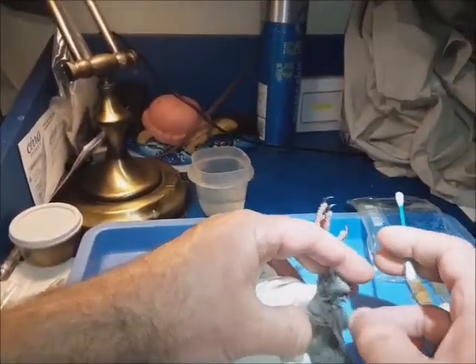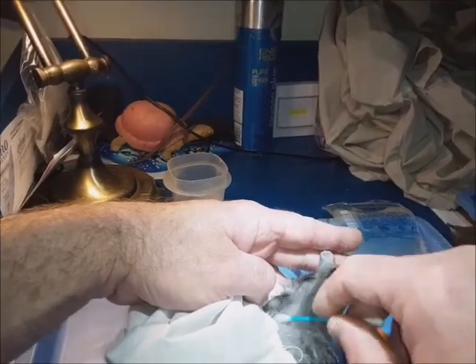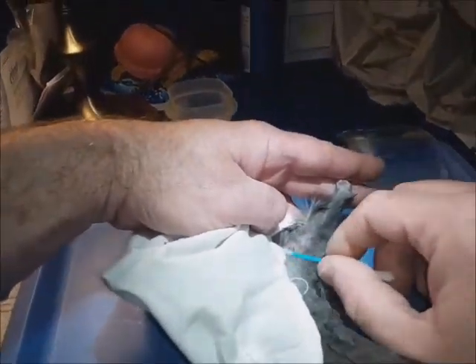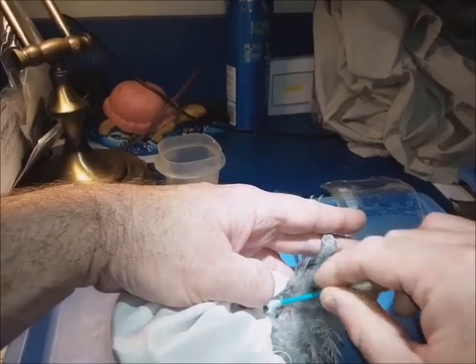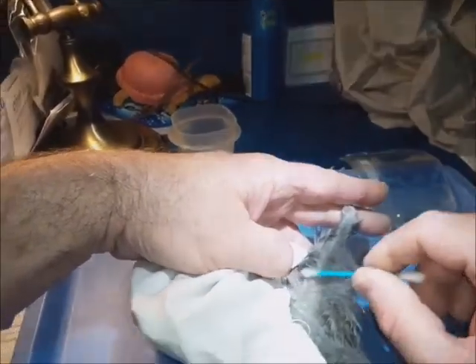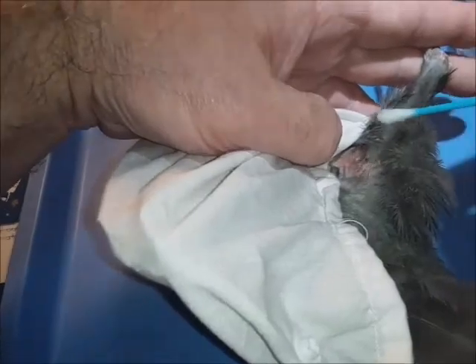It helps to have a helper, a second person to hold the pigeon. You see, if you dampen the feathers, they clump together and it's easier to pull them out of the way so you can see the skin.